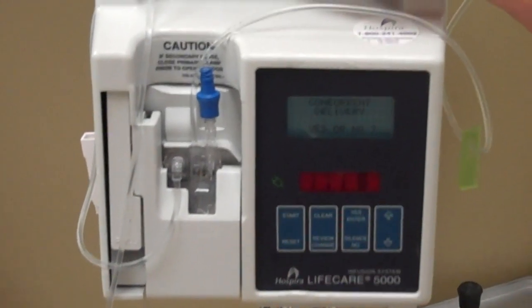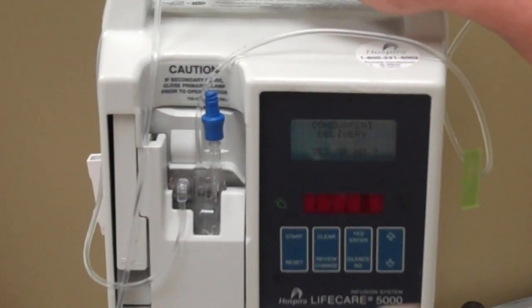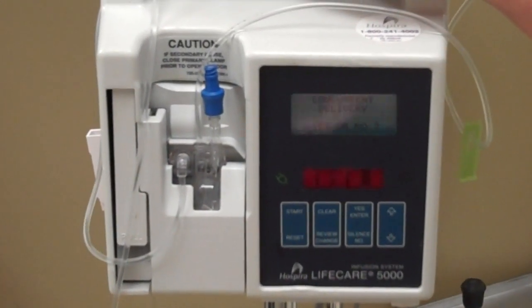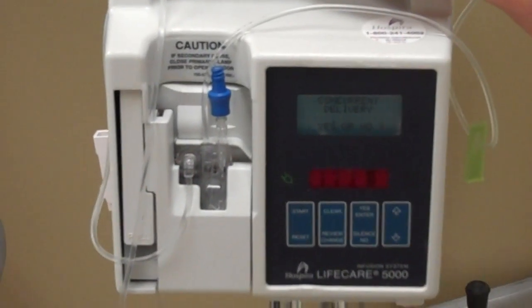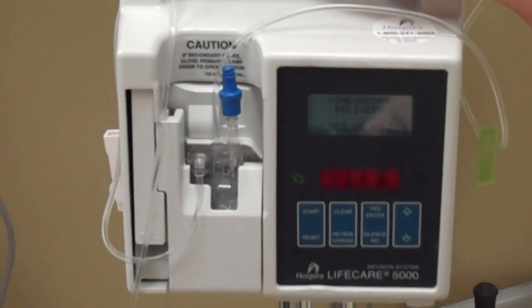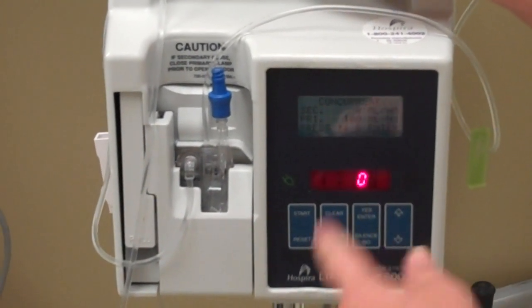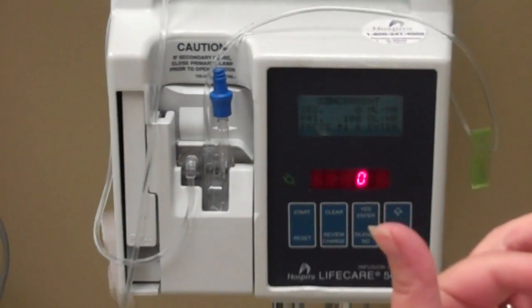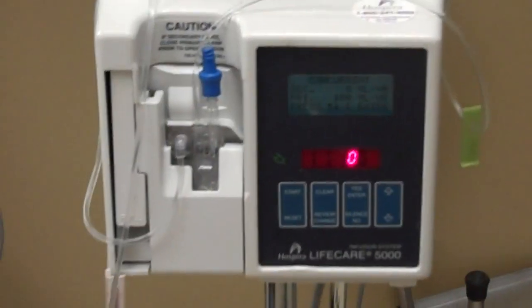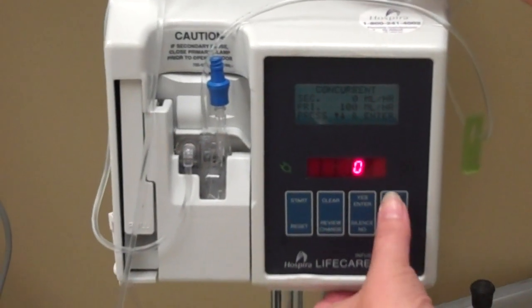Set secondary — yes, I'm going to set secondary. Concurrent delivery means at the same time. You could say yes, run it at the same time, or no, let the secondary run and let the primary kick back in. Usually people run it at the same time, so I'm going to say yes, they can run at the same time. Then it asks for the rate. Let's say there's 50 cc's in this secondary bag and it needs to go over an hour, so I'm going to set it at 50 cc's. Hit enter.